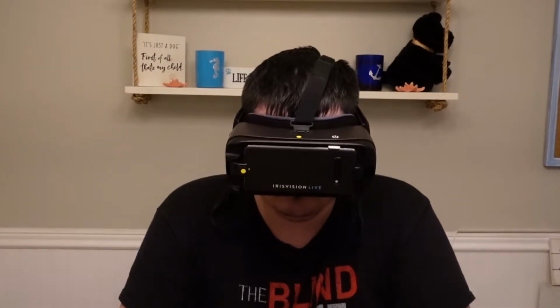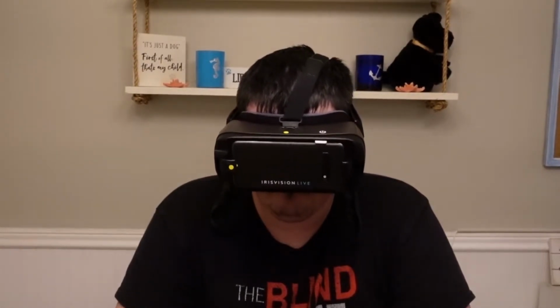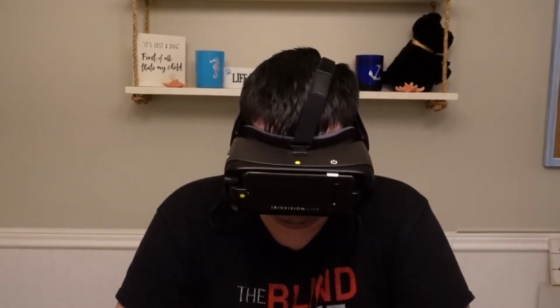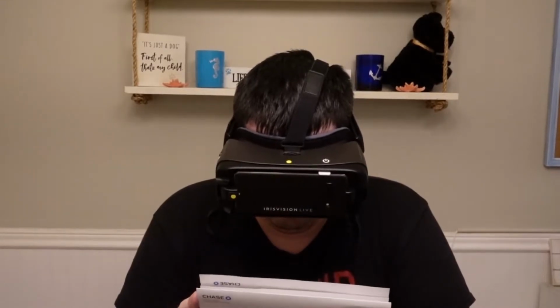So let's go ahead and go to the reading line. With reading line, it presents a text in black letters on white background. It also provides a magnification bar in the center of the screen to magnify one or more lines of text while allowing a normal view above and below the bar.